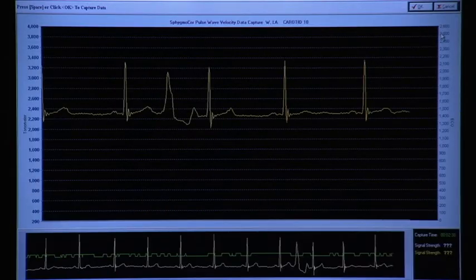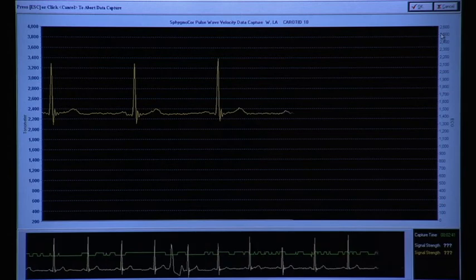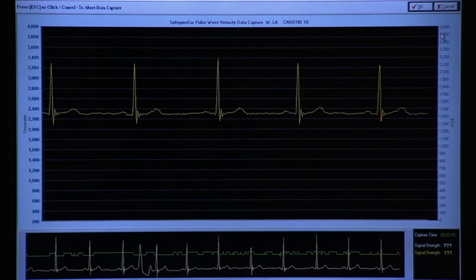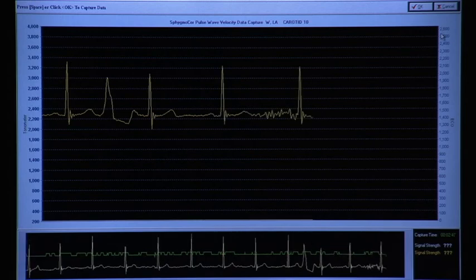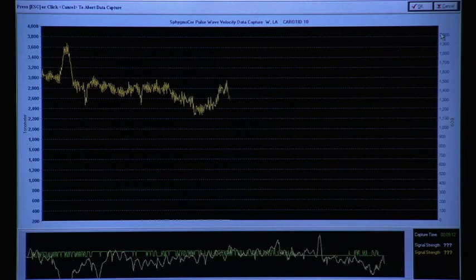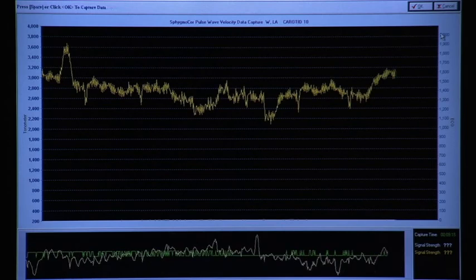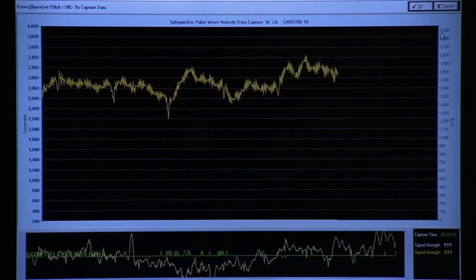Examine the quality of the yellow ECG tracing on the screen. The spike of the R wave should be prominent. A small amount of artifact is acceptable as long as the QRS complex is tall and clear. If you notice that the ECG signal is poor, make sure that you have applied and placed the leads correctly. If so, try another lead configuration.